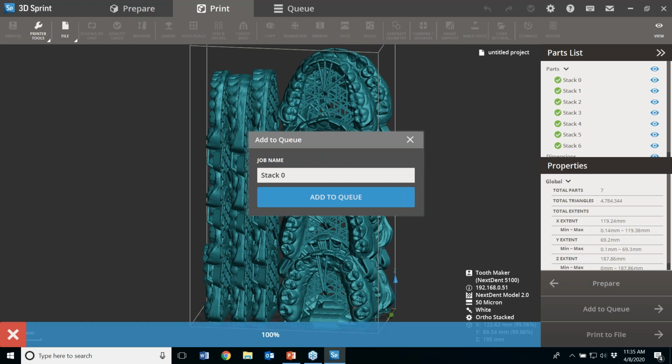Are there any questions about that process? Yeah, you had mentioned you took off the patient names. Is there a certain way that you label all of them since you have so many so you can identify them afterwards? Most software will put a little number for the series on the model itself. So even though the file names are getting renamed and put into a stack, your arches will all be identifiable visually. Okay, perfect. Thank you. It won't remove any labeling on the actual arch itself, just on the file name, that's all. Okay.